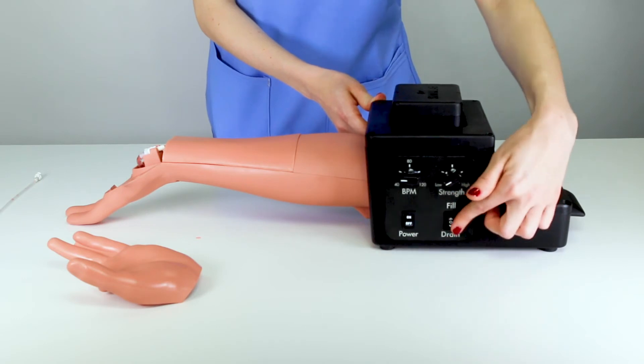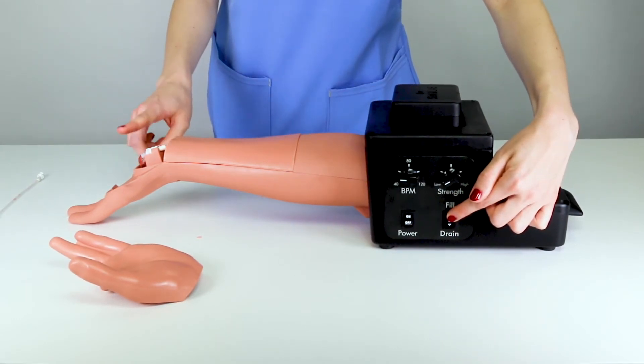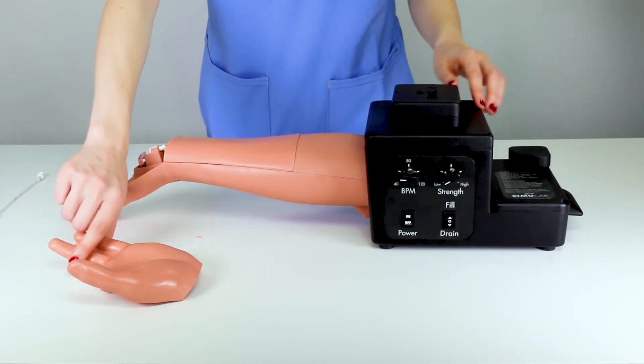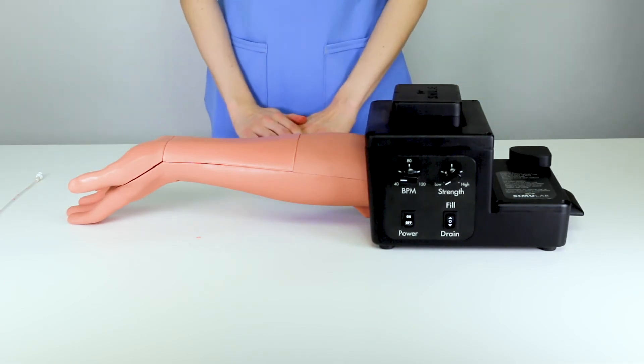Hold the fill button for 3 to 5 seconds or until the line is clear of air bubbles. Replace the hand cover. Your trainer is now ready for use.